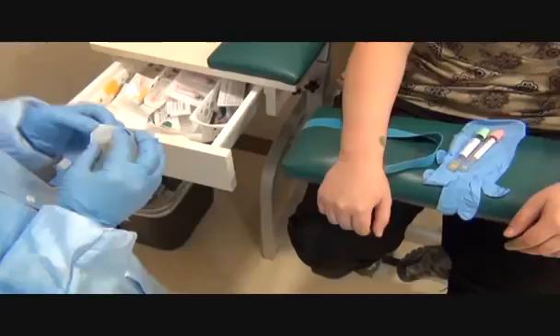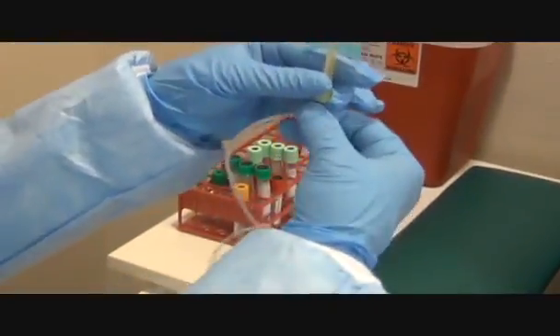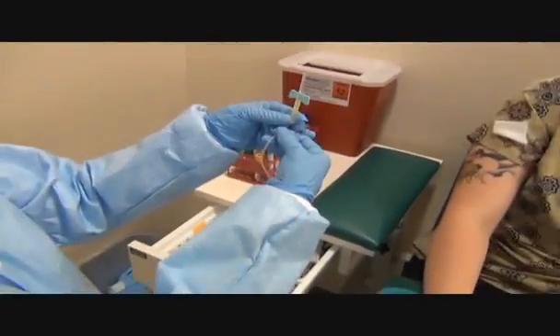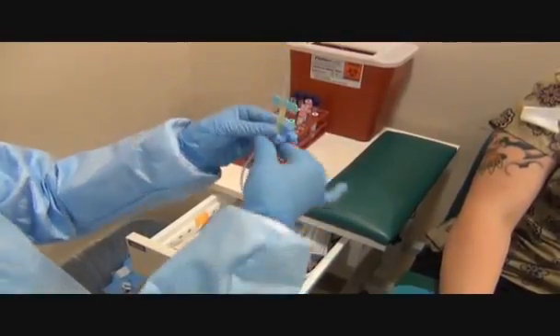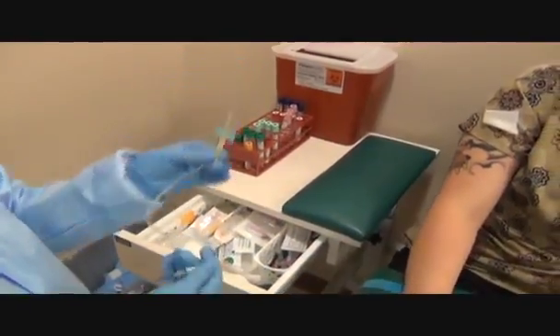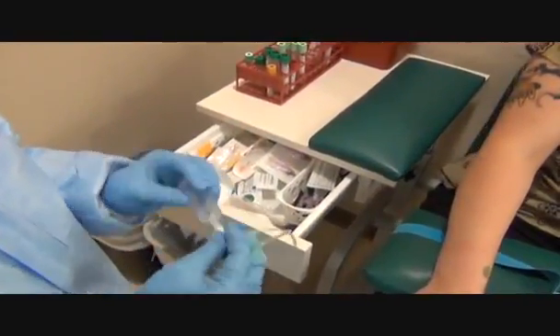I'm going to open up my packaging. This needle is in a plastic so I'm going to remove that. And then I'm going to uncoil my tubing. I want to be careful when I pull on the tubing because if I pull too hard it will pull the needle in, because that's the way it's activated. So I'm going to just lightly pull it straight — give it a couple tugs so it can uncoil. I'm going to use an ETS method so I'm going to add a hub. You can also use this with a syringe.